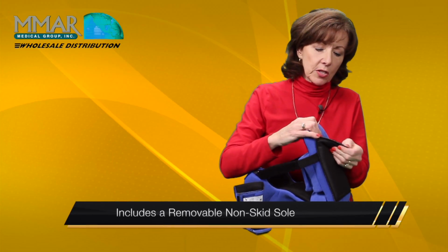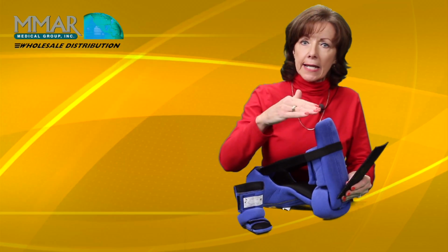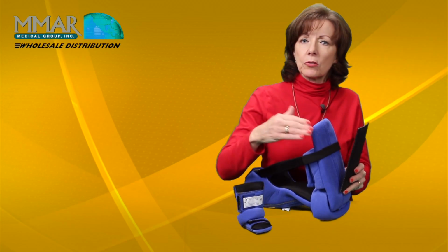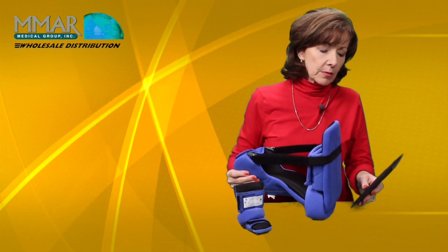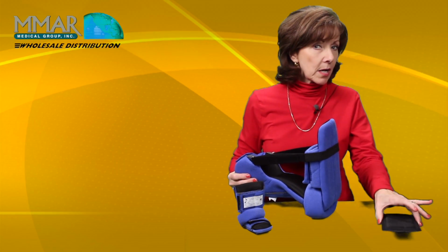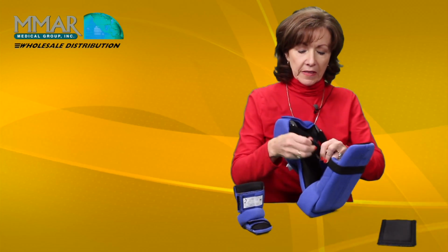It has a non-skid sole that you're going to put on when they're out of bed. Even for transfers, it keeps them from sliding when you're going from bed to chair, chair to commode, or if you're doing just short walking, again, like from chair to commode. But that comes off when you put them in bed, so what's on the floor stays on the floor and not in their bed. You're simply going to fit the boot.